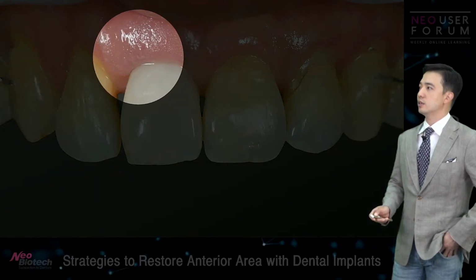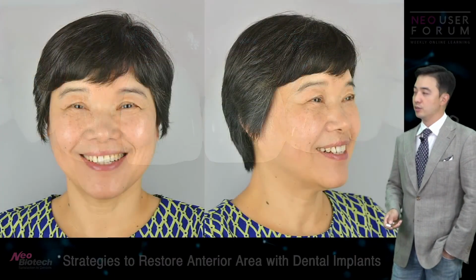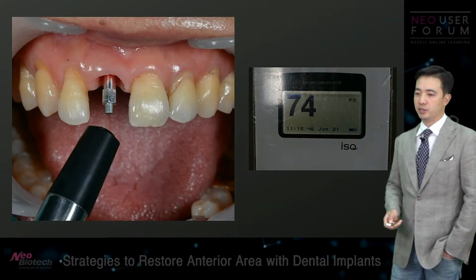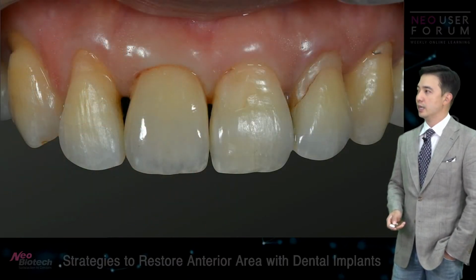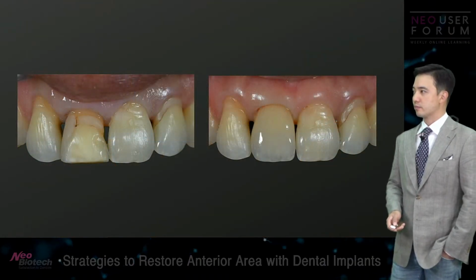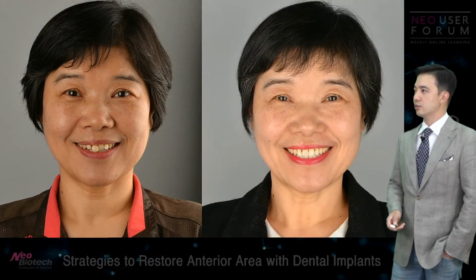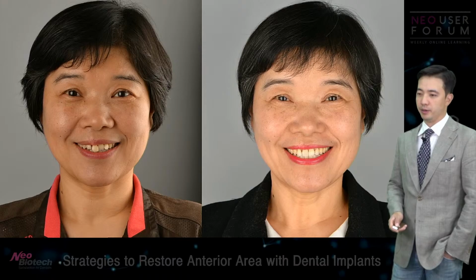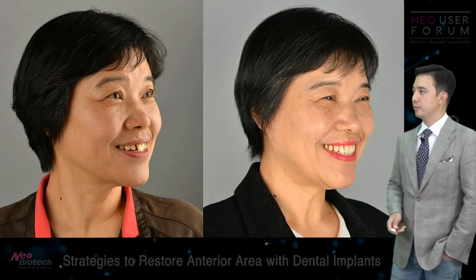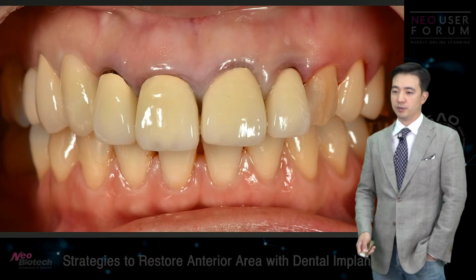So day of surgery, this is the very next day. See how well the soft tissue healed in one day, right? The patient was really happy about her smile with the provisional, and then we measured the ISQ value, went ahead, and finished the case. So yeah, from here to here, I think this case took about a year, but it was really worth waiting. The patient didn't really suffer from any big surgeries, but ended up having that beautiful smile.